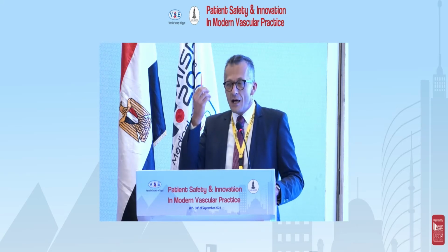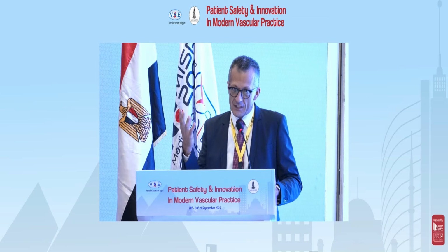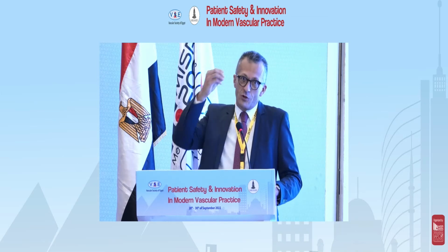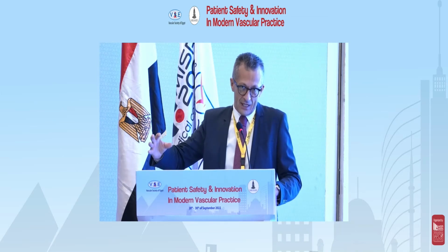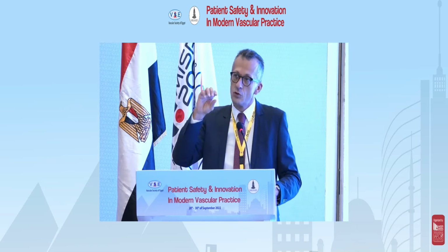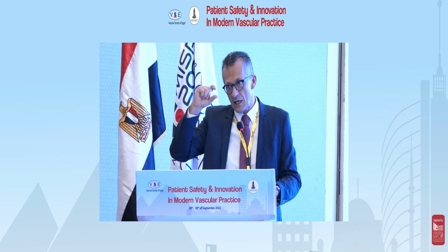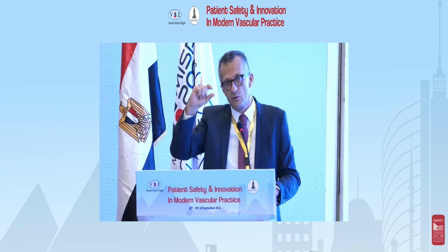When I perform the first passage, I'm not sure to have removed all the material. Then I decide to go until 1 centimeter with the device above the last part of the occlusion, and stop.